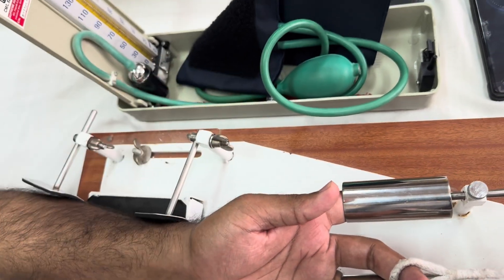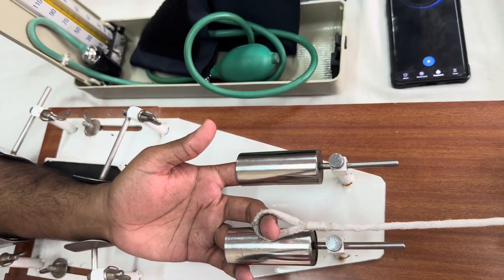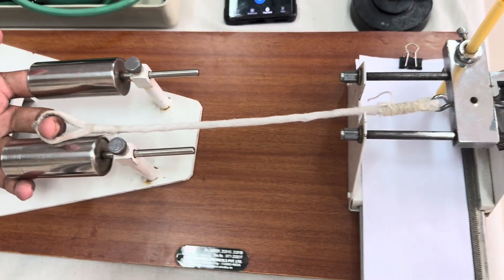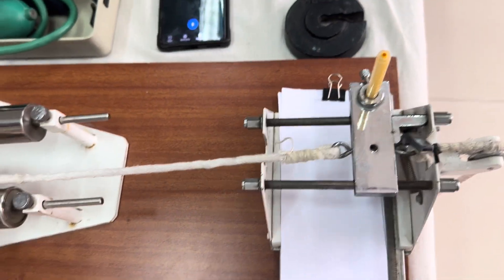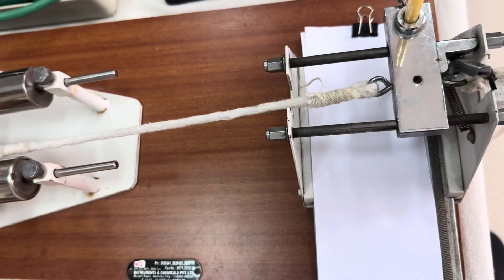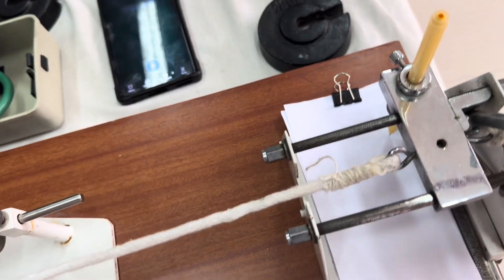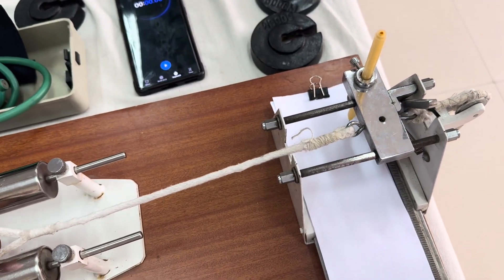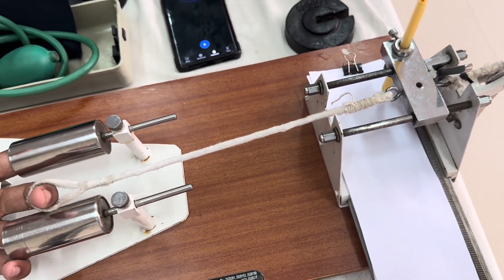The clamp should be just tight enough so that the forearm is kept in place. You can also adjust the finger holders using the screws provided. On the other end there is a recording device — a movable plate — and we have placed a writing pen on it. This movable slide will slide as the person lifts the weight. The point will be more clear once we start the procedure.